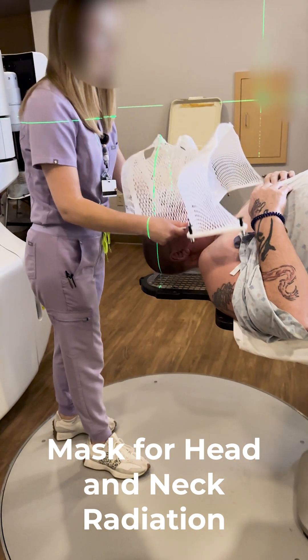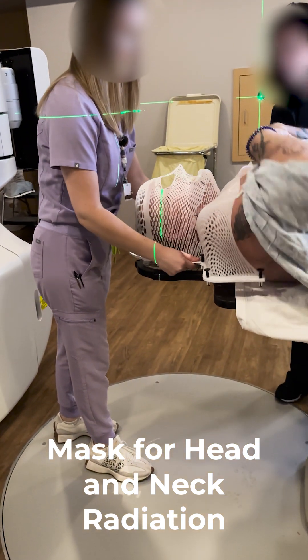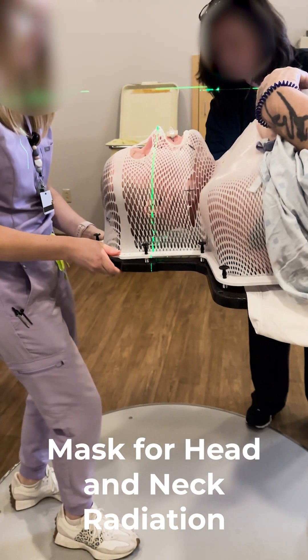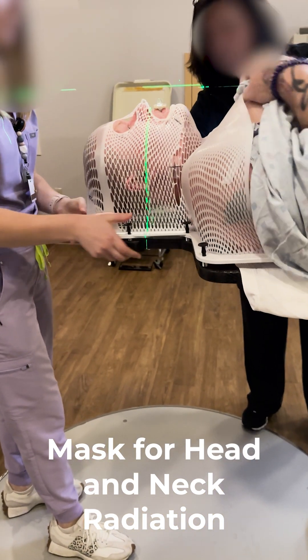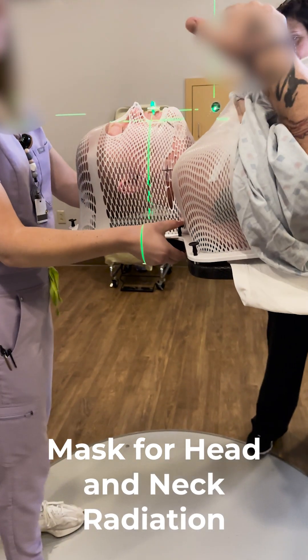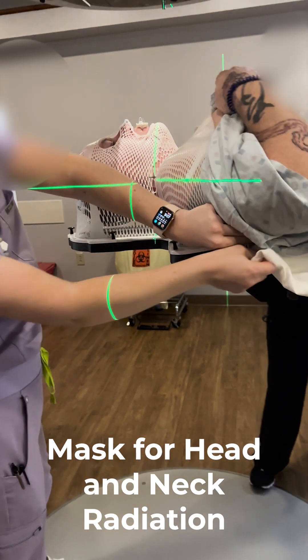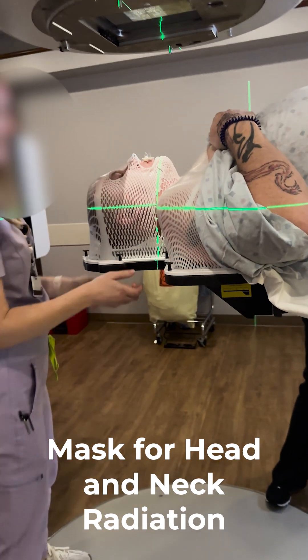First they put a mouthpiece in to help keep my mouth in place, then I wiggle just a little bit — you'll see right there — and I'm just helping to settle into the mask on my face where it fits just the way it did originally. Then they'll do the CT scan after they leave.